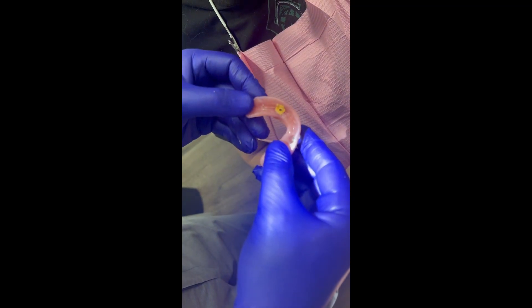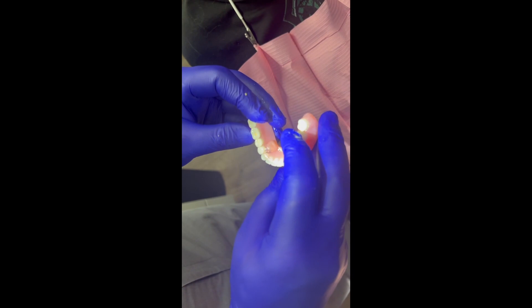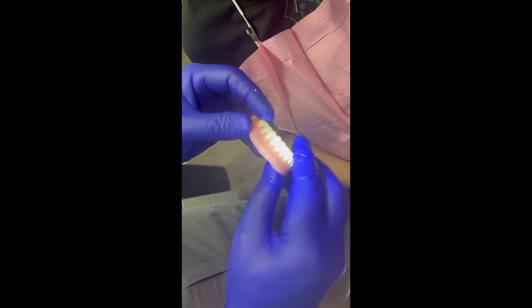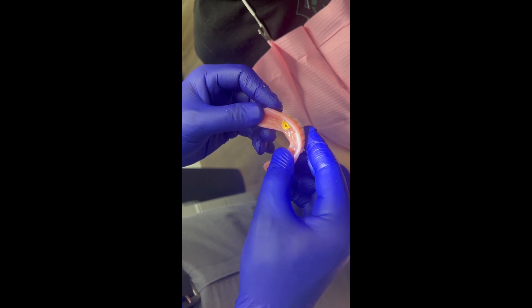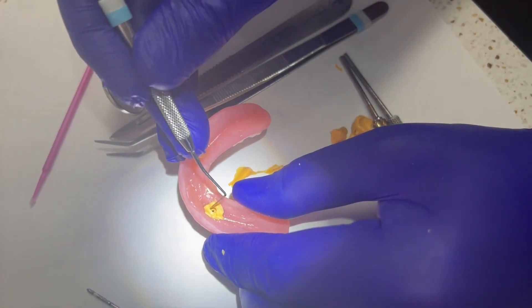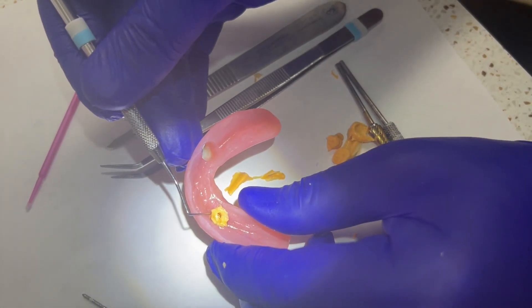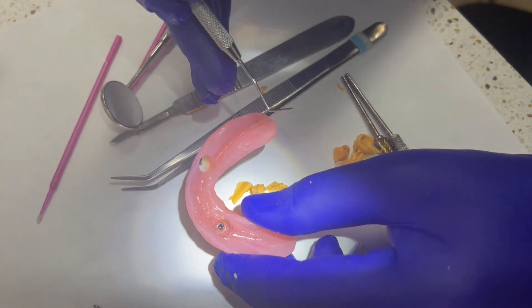The patient expressed that it was hot. If I did not have the custom block-out, this potentially would not have come out of her mouth and it would have caused a huge issue. But because I had the custom block-out, it came out cleanly and we're good. Now I'm going to take out the custom block-out and move to the other side.